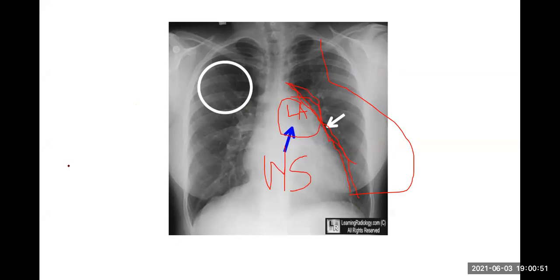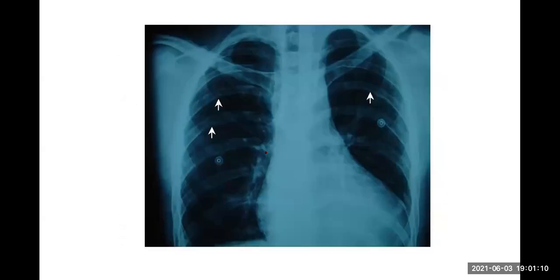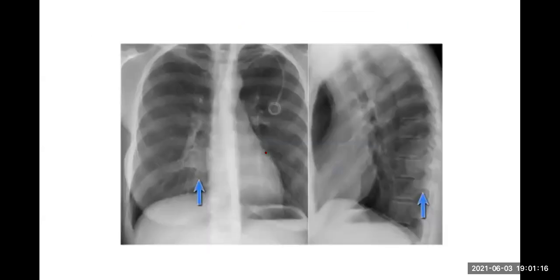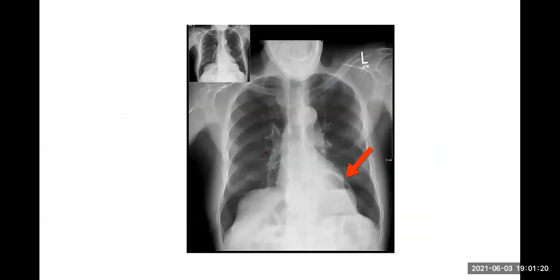In the cardiac shadow itself, you will see these two things: cardiomegaly, which comes up frequently when you see patients, and also this straightening of the left heart border in mitral stenosis. Right. I think that's enough. I will teach the additional level later, but just for basics today, I think that is more than adequate.